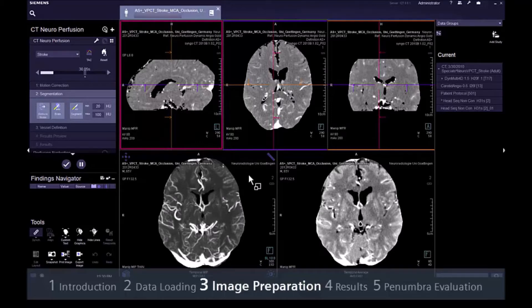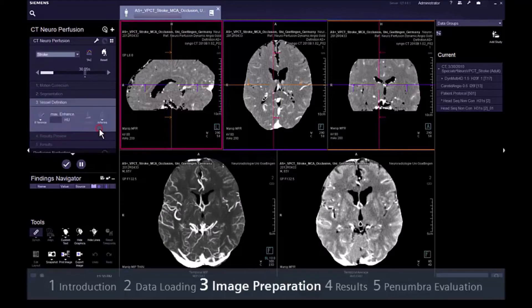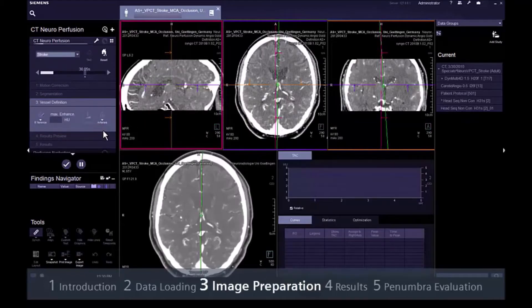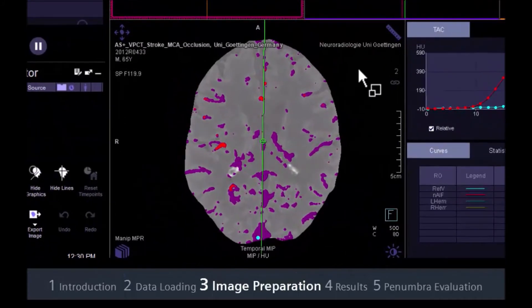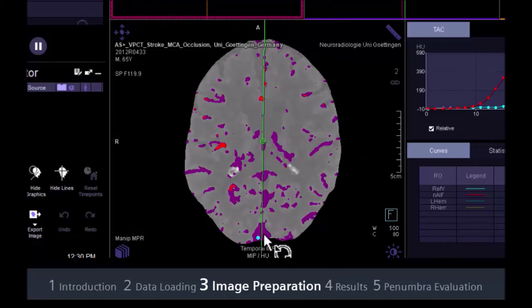When switching from Step 2, Segmentation, to Step 3, Vessel Definition, all major vessels are detected and displayed in Magenta. The reference vessel, typically the Sinus Sagittalis, is detected with a blue area, and the arterial input voxels are marked in red.